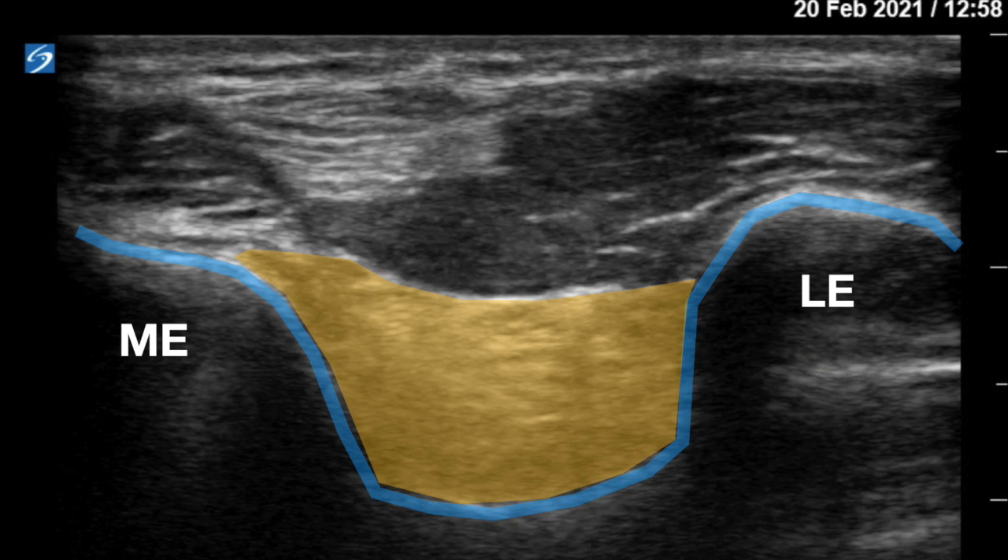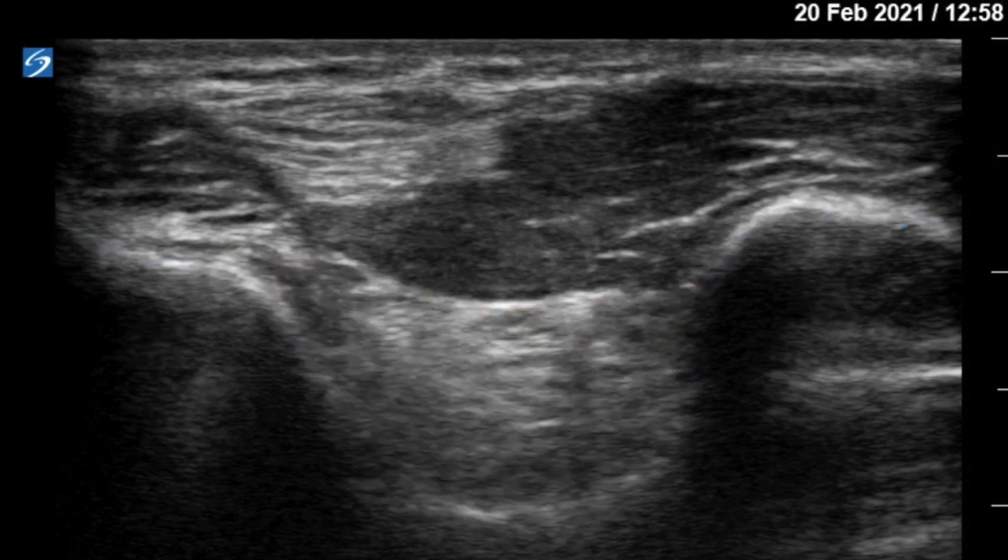On the posterior elbow ultrasound, you can recognize the cortex of the distal humerus as the blue line. Note that there are two humps: the hump on the left is the medial epicondyle, the hump on the right is the lateral epicondyle, and in the middle is the olecranon fossa. The posterior fat pad sits snugly in the olecranon fossa and if you draw a line between the epicondyles, that fat pad should be below that line.